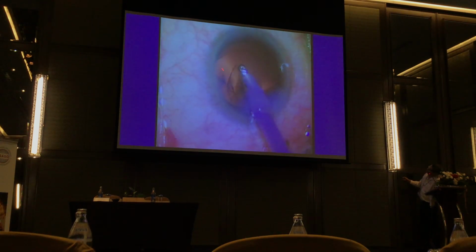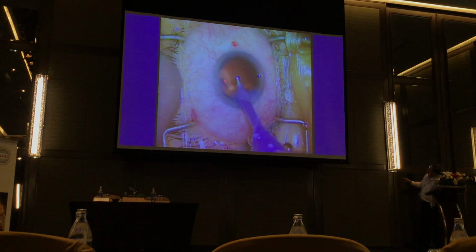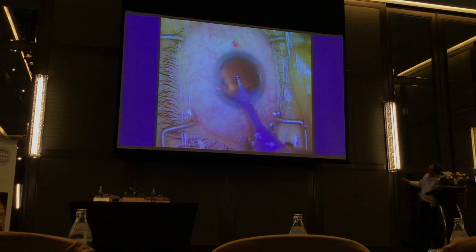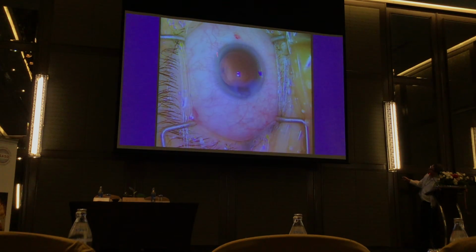Okay, and so you see the two flaps here, and we'll see whether they flap about. So you can see there's the flap there, and it's flapping about a little bit, which according to Prakash means that it hasn't extended. So I'm telling my resident, there it is, be careful, and now we're just going to take the instrument out and watch.